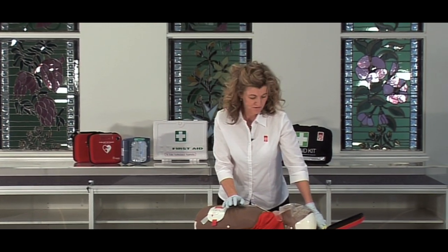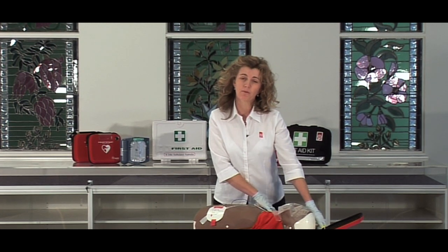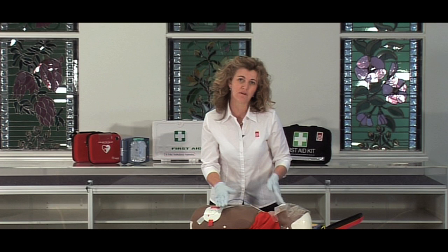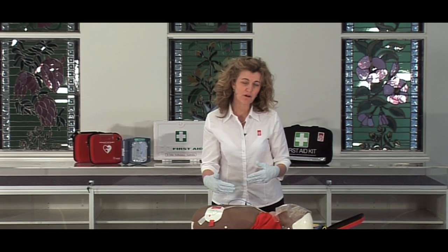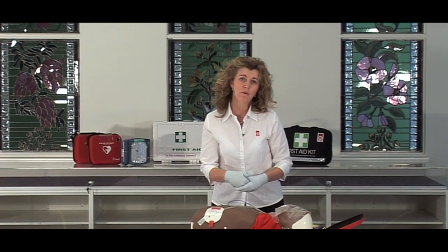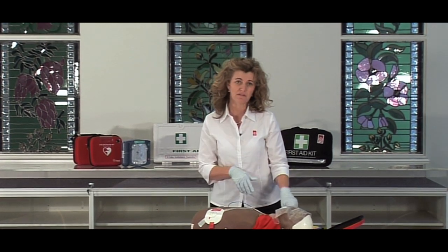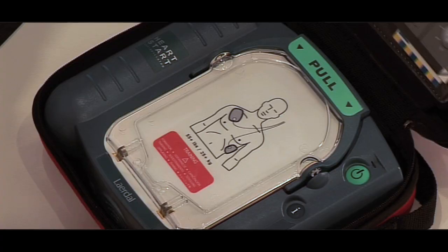Continue doing the compressions or following the prompts on the machine until the ambulance arrives. Do not take the pads off, because it continues to analyse. Sometimes the patient may flick back into what we call ventricular fibrillation, and it will tell you to stand clear and press the flashing orange button again. For more information on defibrillators, you can go to stjohn.org.au or give us a call on 1300 360 425.